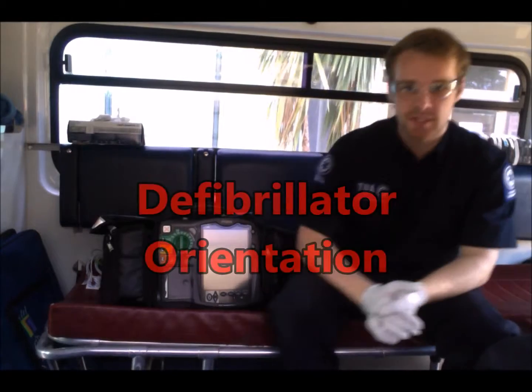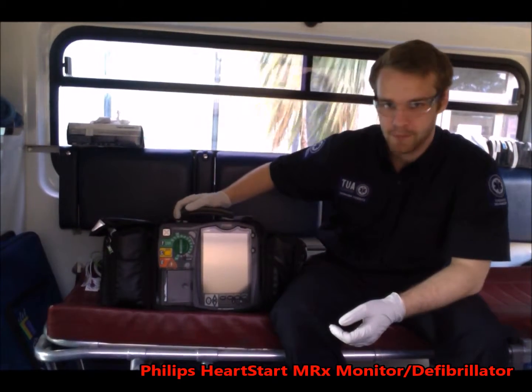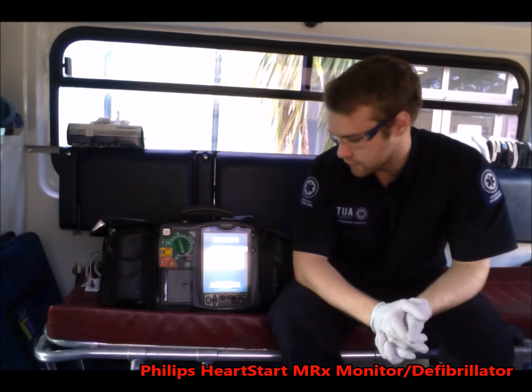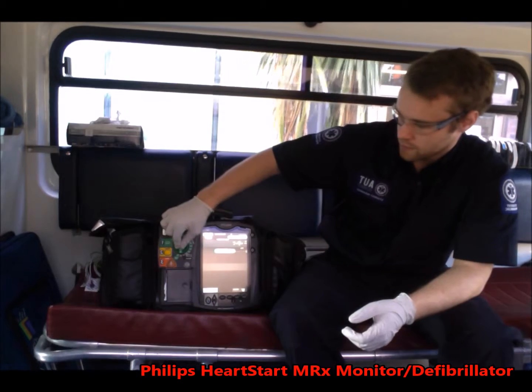I'm going to do a defib orientation. So this here is the Philips MRX. So first of all you want to turn on the monitor. So this is it here turning on. That's it on. Just got to check the batteries.